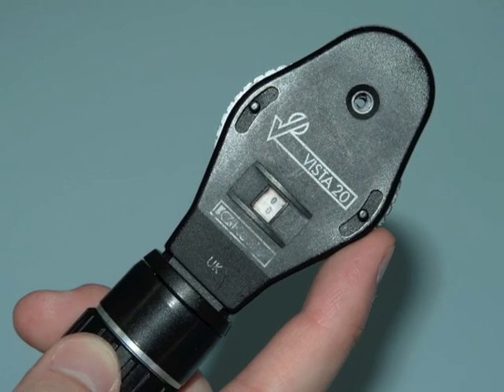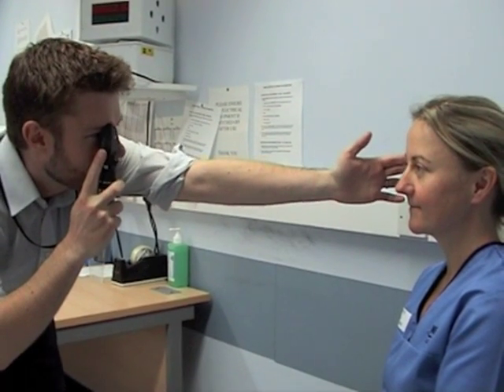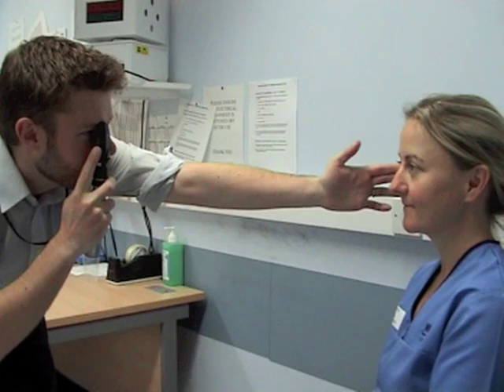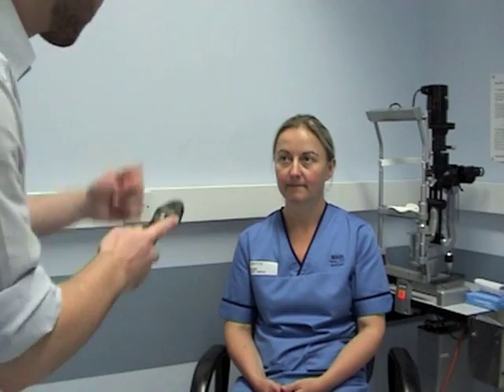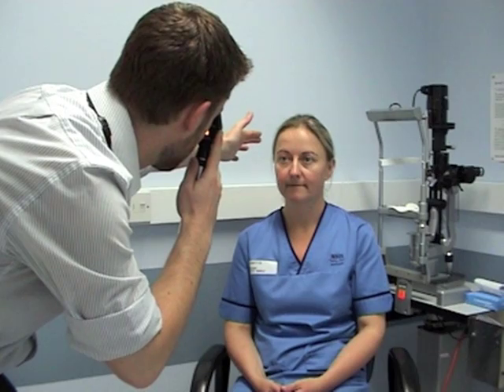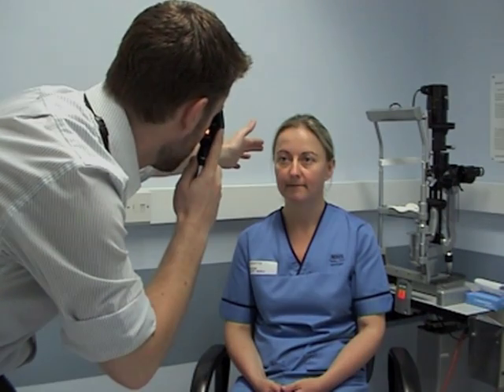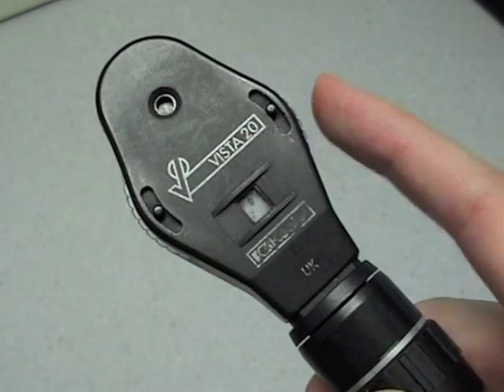The first step in examination is checking for a red reflex. This is done by dialing up a zero lens and standing at arm's length from the patient. One eye is then compared to the other by looking through the eyepiece and looking for the red reflex. This is essentially a reflection of the light off the retina and can be reduced by any opacities in the media between the front and back of the eye, such as cataract, vitreous haemorrhage, or retinal detachment.